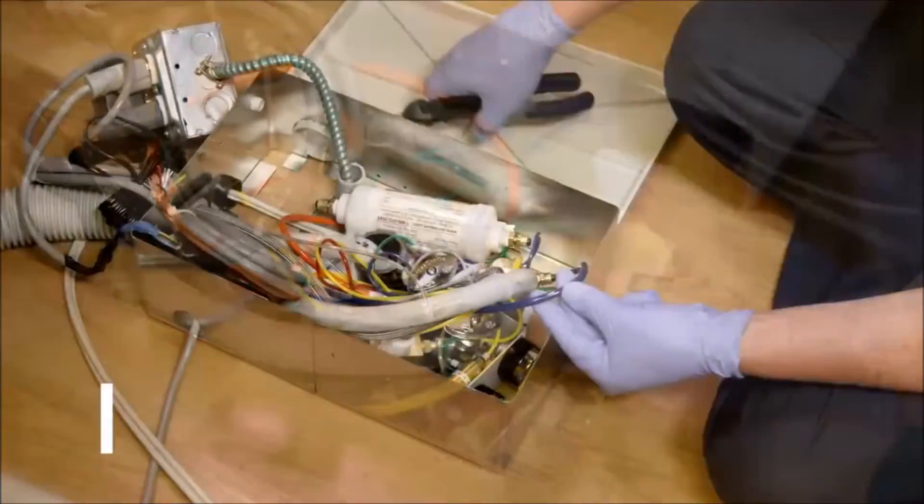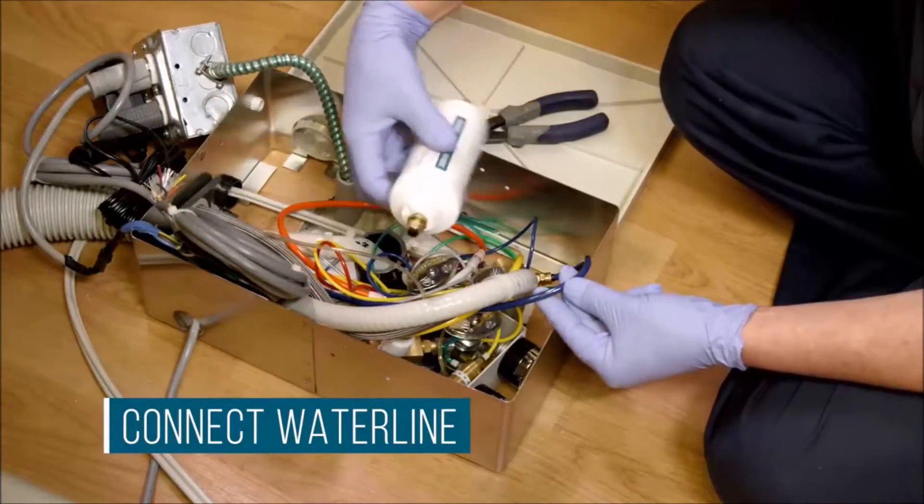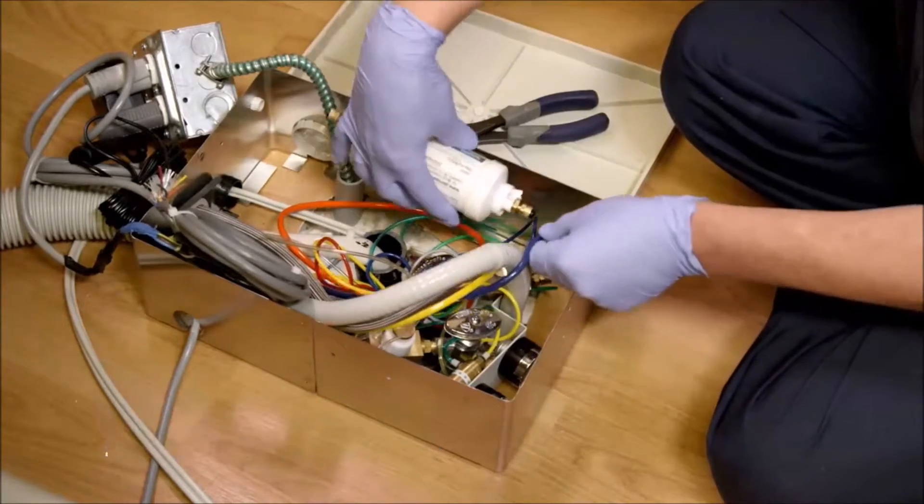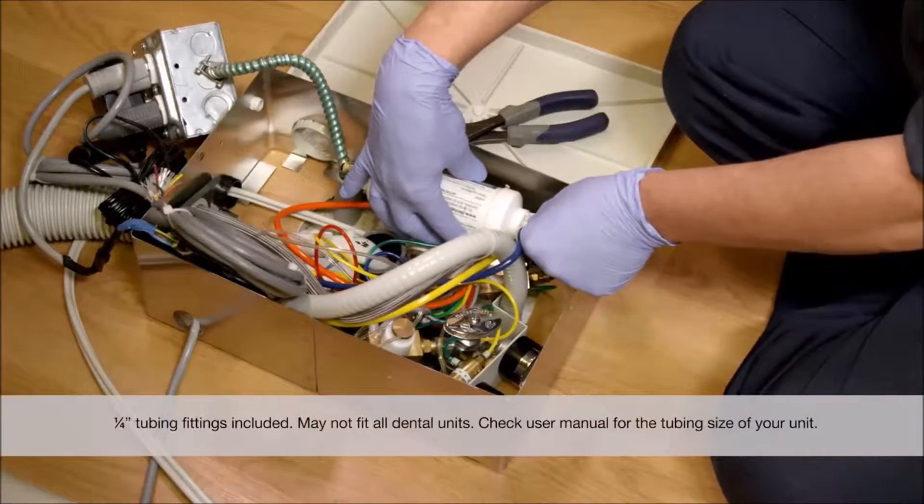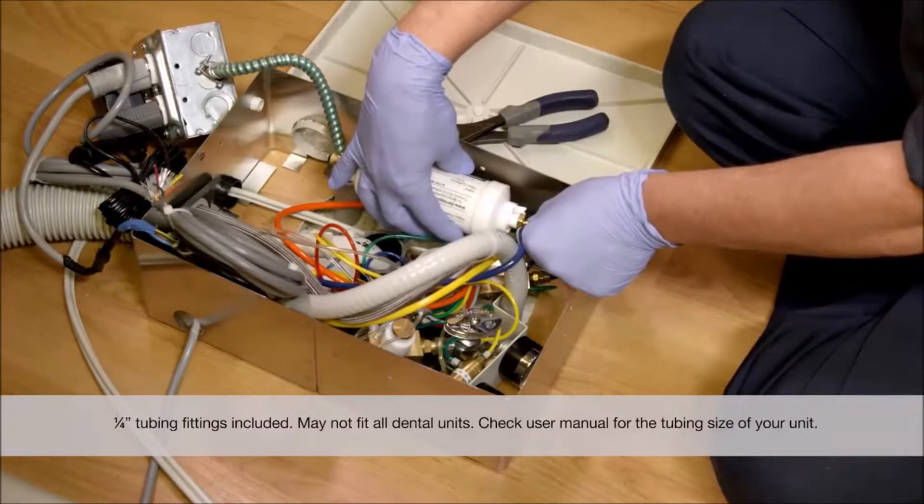Next, you'll connect the water line to the Dentipure cartridge. Measure your water line from the regulator to ensure you will have enough tubing to reach both the inflow and outflow sides of the cartridge.